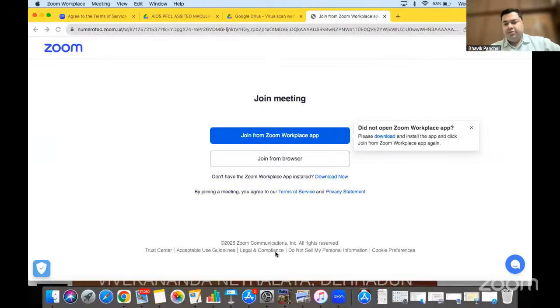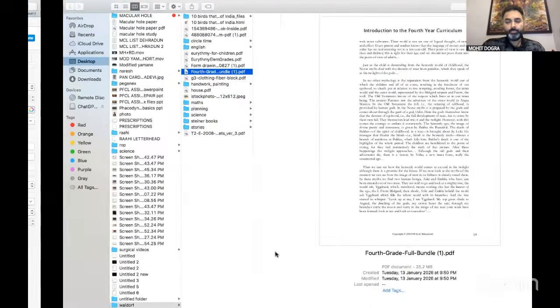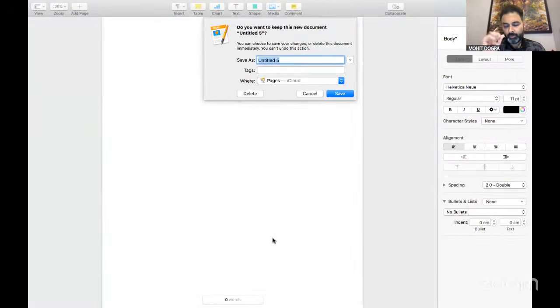By then, Dr. Chintan shares his presentation. Dr. Mohit, your thoughts on a visco-assisted ILM flap closure? I think the technique shown by Avnish was great, but a word of caution.